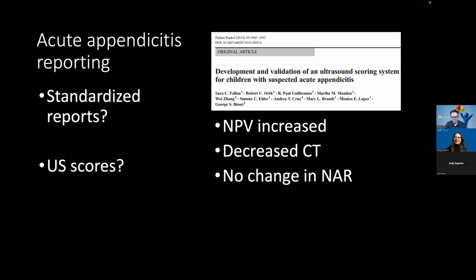So once again, I've experienced both. Before I trained and worked, we had a standardized report. Currently, we do not. What are your thoughts on it? And do you use it? Yeah, I'm definitely a big fan. I think it adds a lot of value.